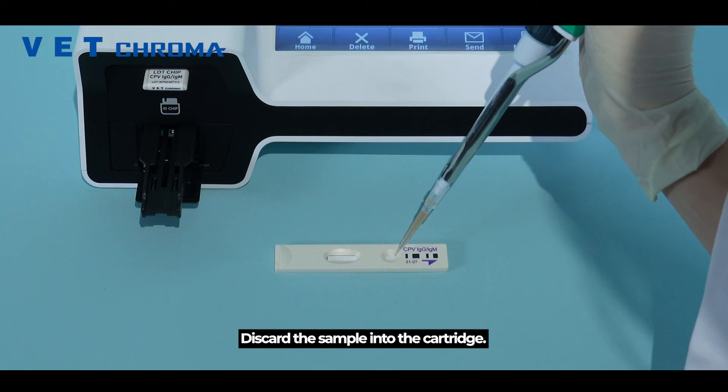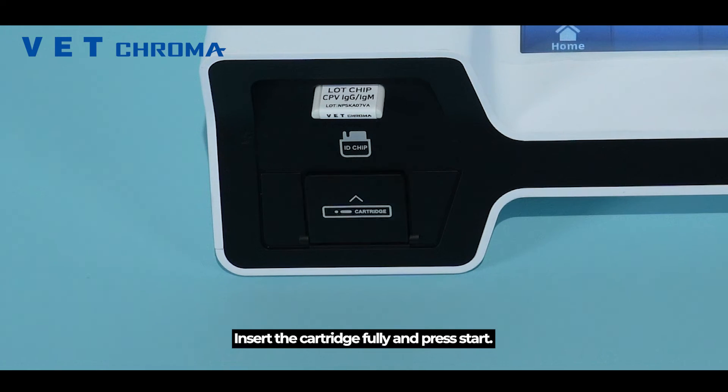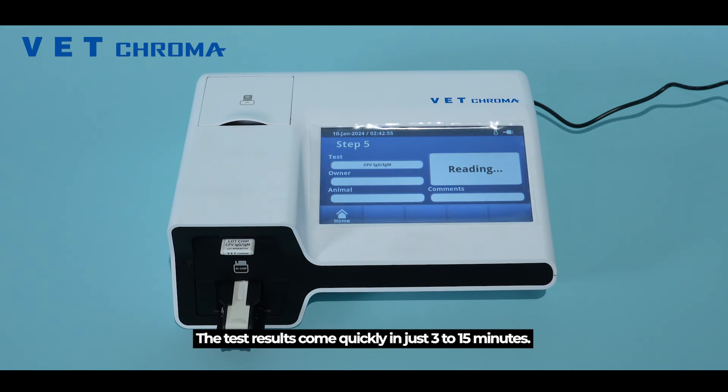Simply insert the lot chip into the port, dispense the sample into the cartridge, insert the cartridge fully, and press start. The test results are completed in just three to fifteen minutes.